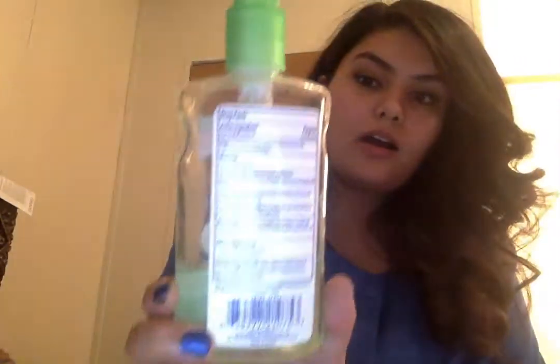We are going to perform our handy dandy hand hygiene. So we're going to wash our hands. Washing our hands. We're going to make sure that the patient is comfortable, that they have everything they need, that they're in a comfortable position. And next, I am going to show you how to take out a catheter.